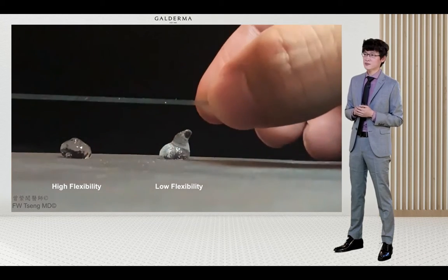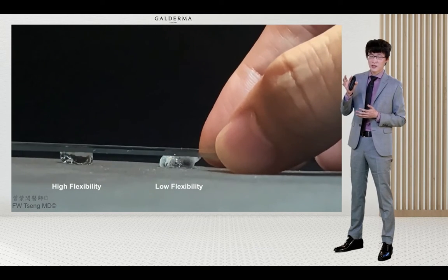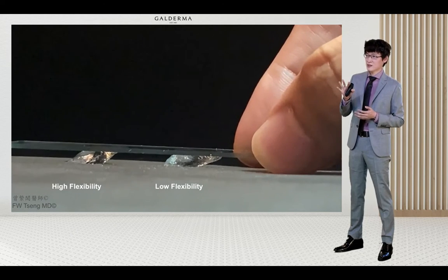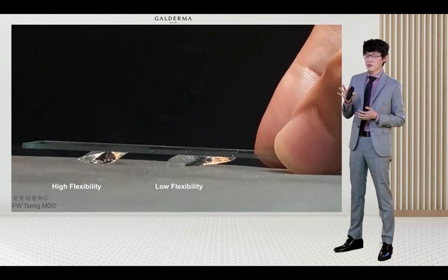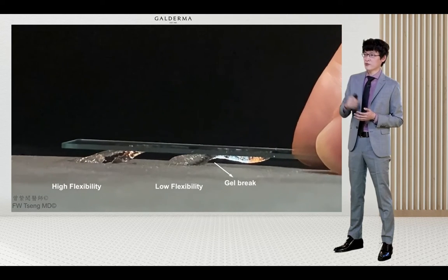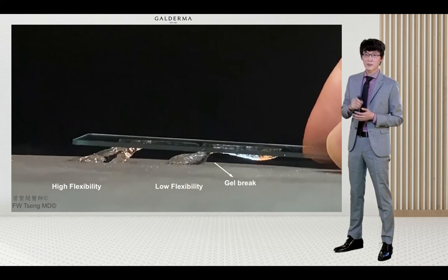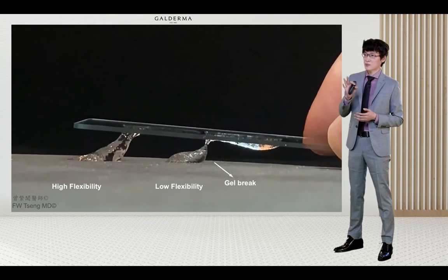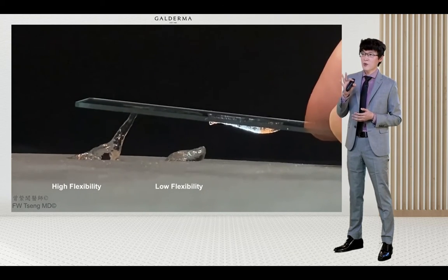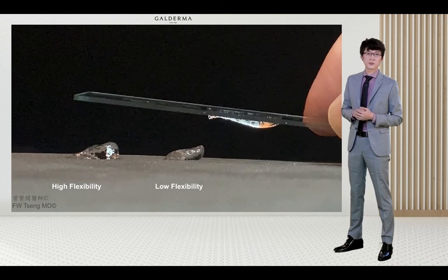in characteristics. So now let's imagine when these two products were injected under the patient's skin, get compressed, get stretched with muscle movement, skin movement, and you can see a certain degree of deformation. The product with lower flexibility breaks apart, while the other product to your left with higher flexibility is more able to maintain its original shape in its original position.